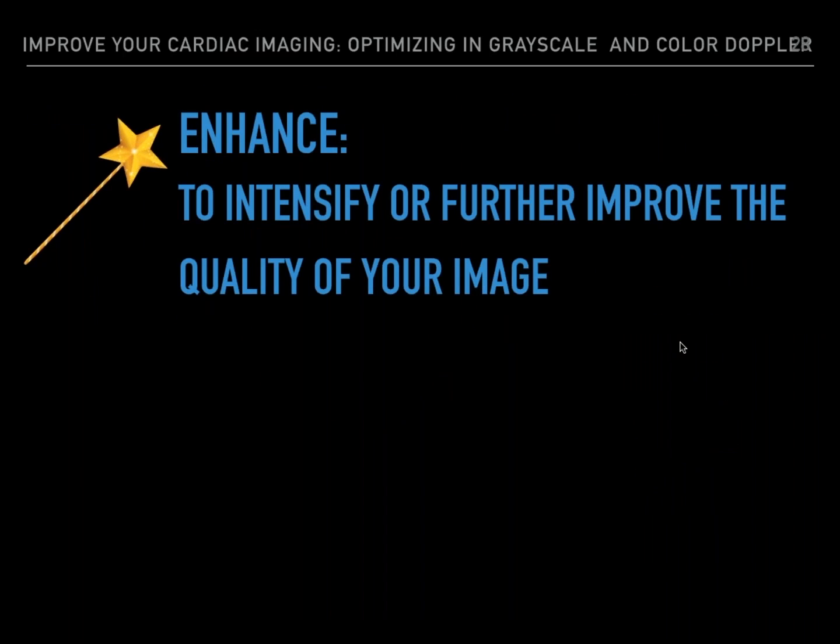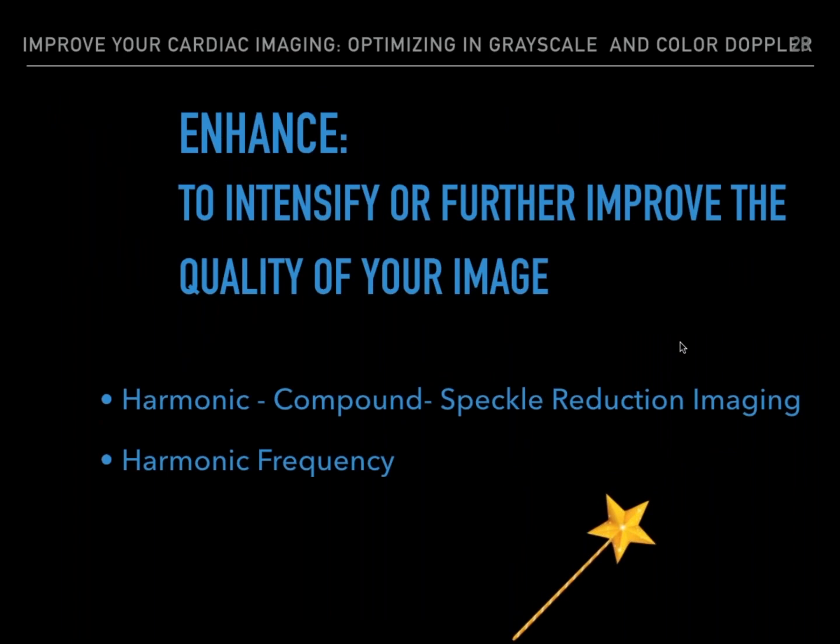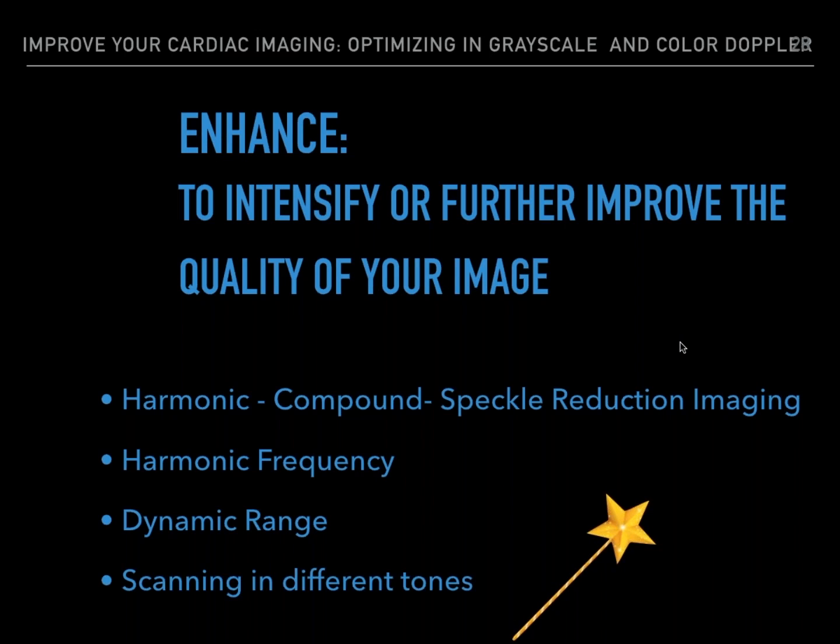So enhance, by definition, is to intensify or further improve the quality of your image. And this is all done just by doing a few adjustments to these few settings: harmonic, compound, speckle reduction imaging, harmonic frequency, dynamic range, or even scanning in different tones.